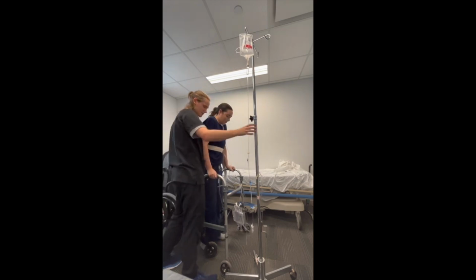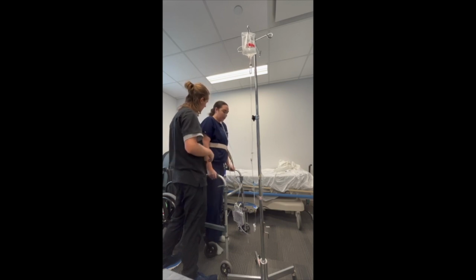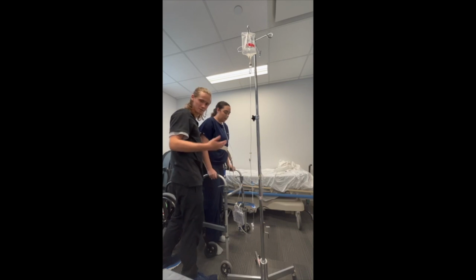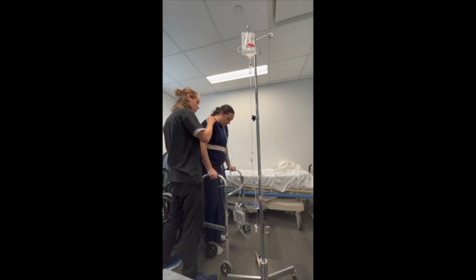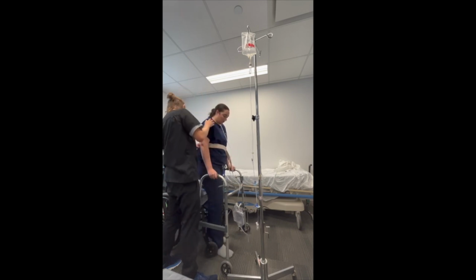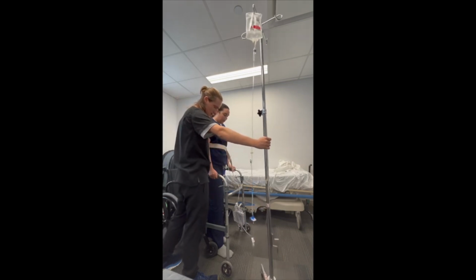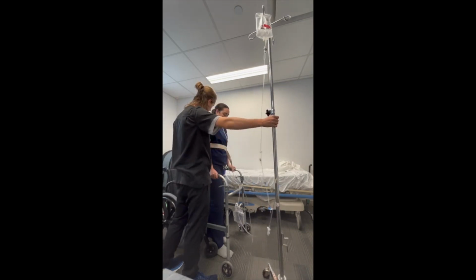Good. Okay, and so before we walk, we want to check in with the patient, see how they're feeling. How are you feeling? Good. No lightheadedness, anything to worry about? Yep. All right, so now we want to check in again with our lines and tubes before walking. So communicate clearly with the patient. All right, let's hang out here for just 1 second, okay? And I'm going to make sure that nothing is hooked on the chair, that we still have some slack here. And we do. So we can take some steps forward.